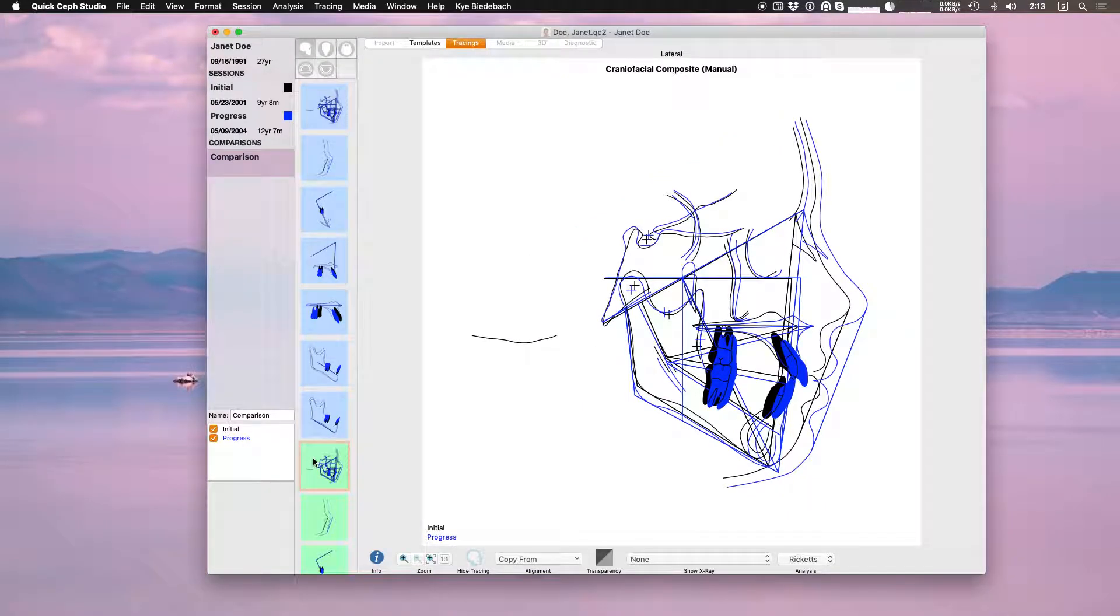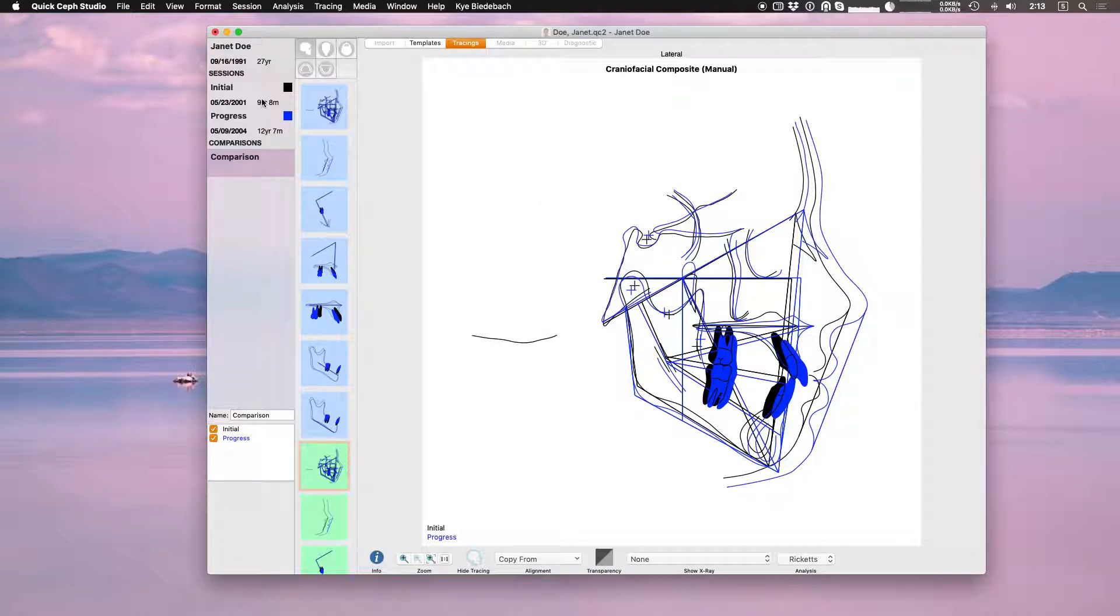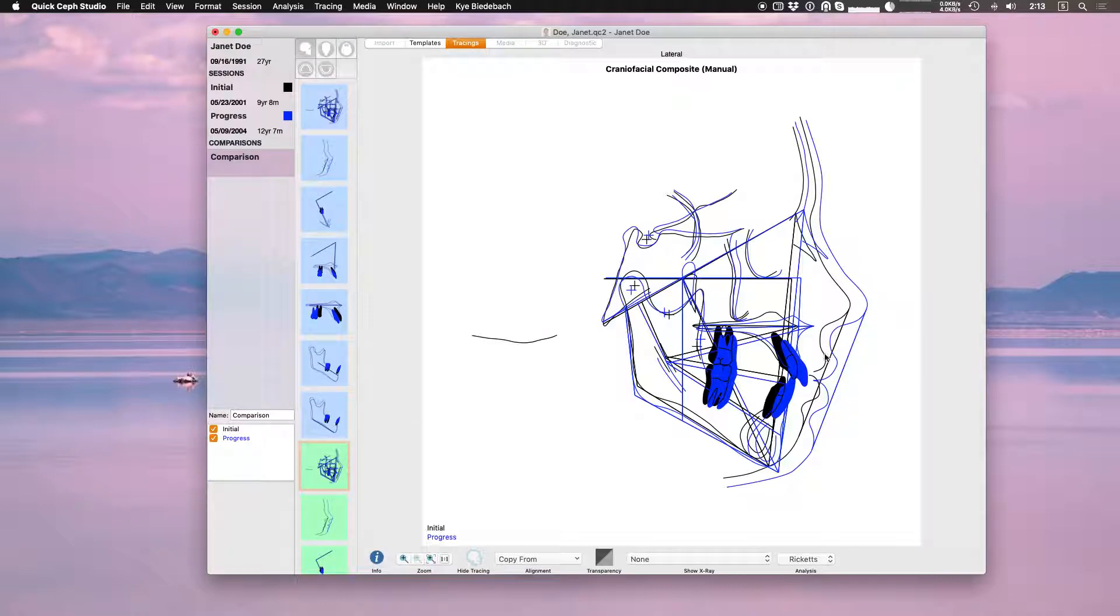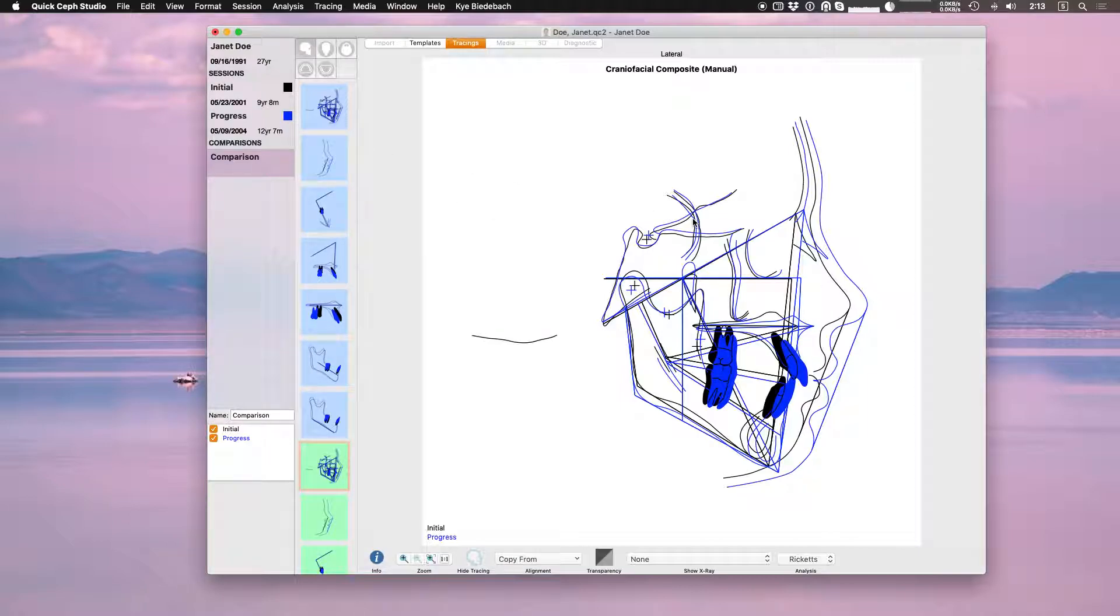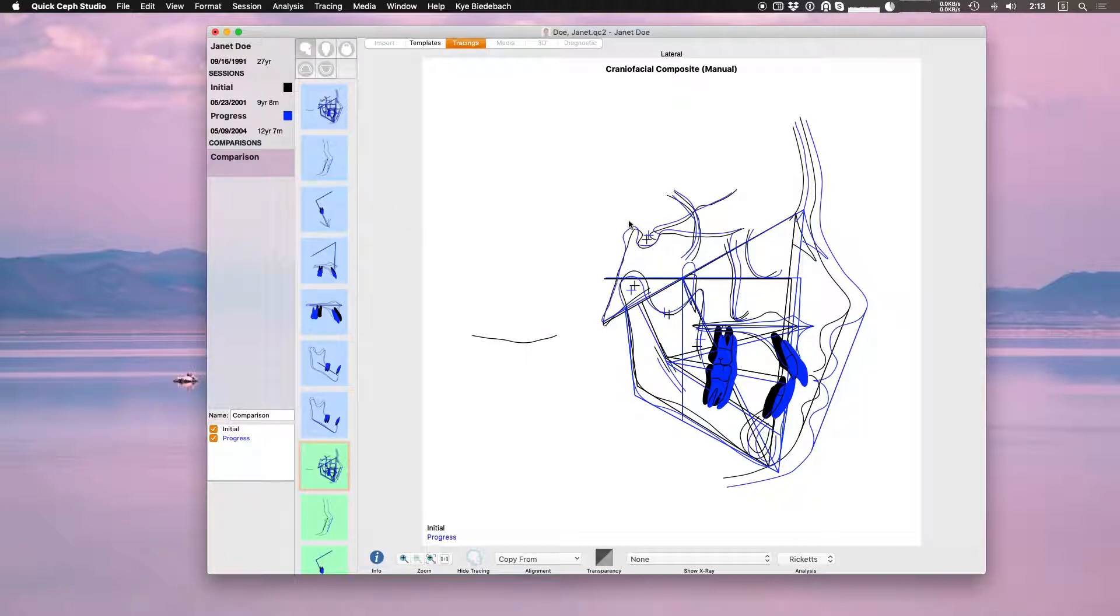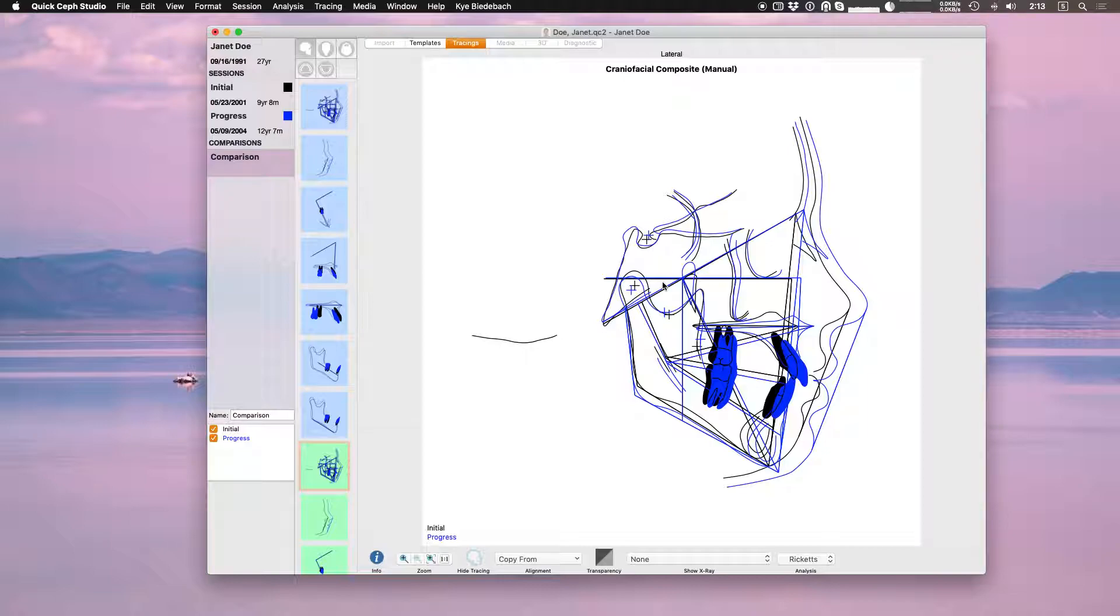Often we get a call where the superimpositions might not look the right size. In this case our initial is black and our progress is blue so we show the growth. Sometimes we'll get a support call saying the progress is smaller than the initial and they expect the progress to be larger. If that's the case then one or both of the sessions is calibrated incorrectly. If it looks like your superimpositions are not the correct size, double-check both of the previous sessions calibrations. If you need help with calibration there's a tutorial video about calibrating x-rays in the QuickSuff Studio tutorial videos website.